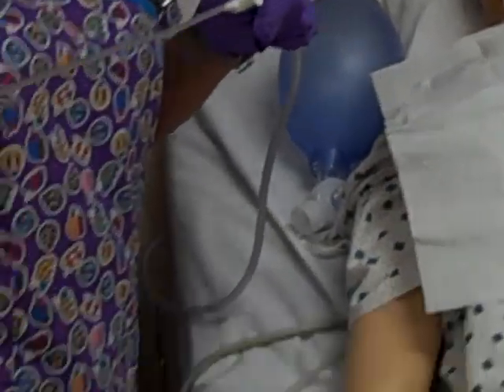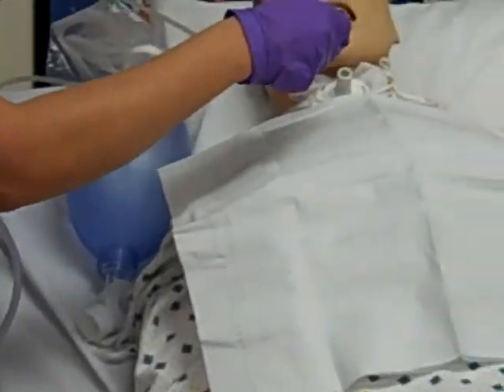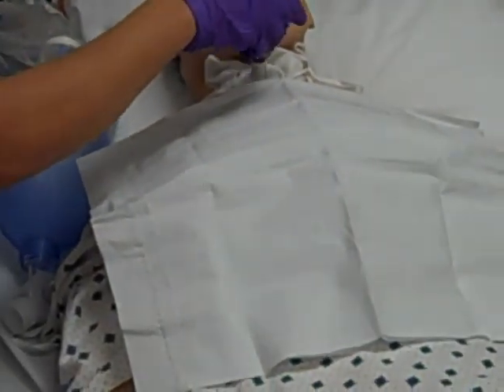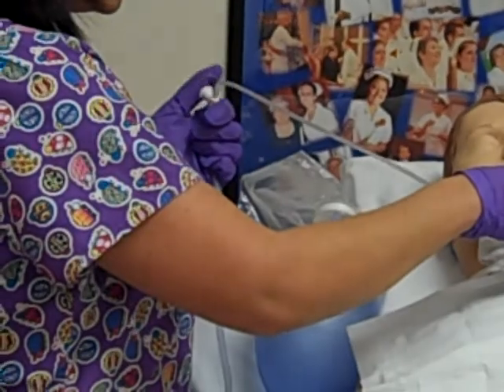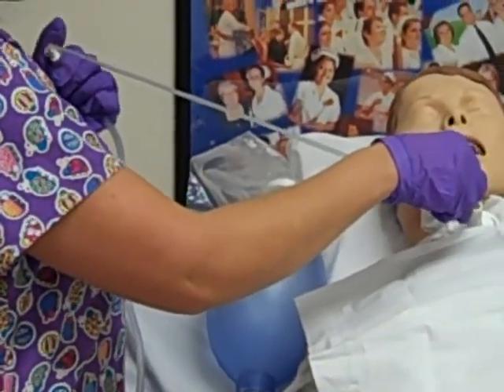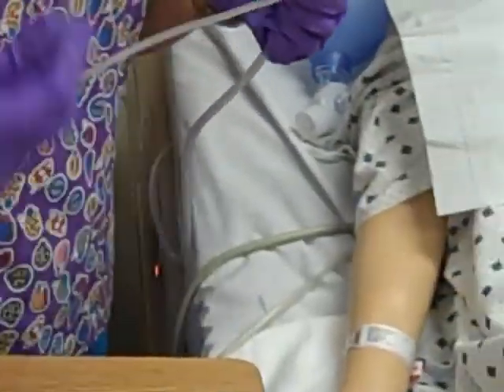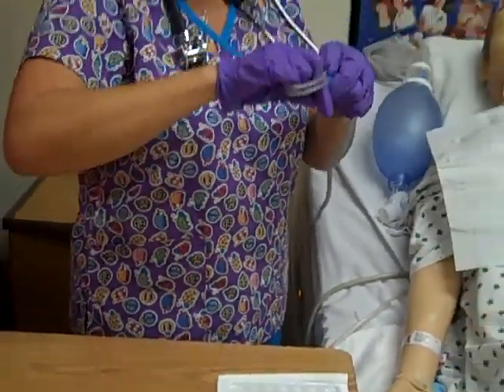You will go in for your last and final cycle. Go in — again, five inches or until I meet resistance. Intermittent suction on the way out, keeping my catheter taut. It's the last time — you can clean it out if you want. If not, you're all done.